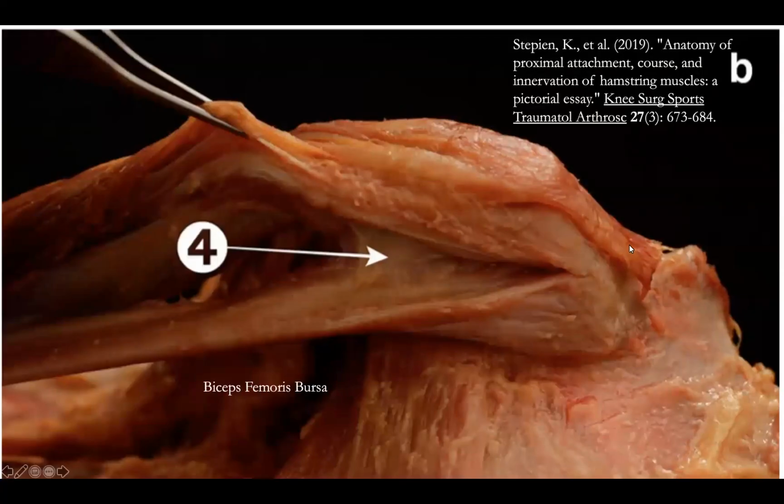Here we see 2 bursae. Overlying the ischium is the ischiogluteal bursa. Imagine the gluteus maximus sitting here. This ischiogluteal bursa would be between the gluteus maximus and the ischial structures. If you were able to separate the conjoint tendon from the underlying semimembranosus tendon, in between is the biceps femoris bursa. On ultrasound, bursa appear as what I like to refer to as a reverse Oreo cookie. The outer white or hyperechoic region represents the peribursal fat, and the inner dark region represents the synovial tissue of the bursal tissue.